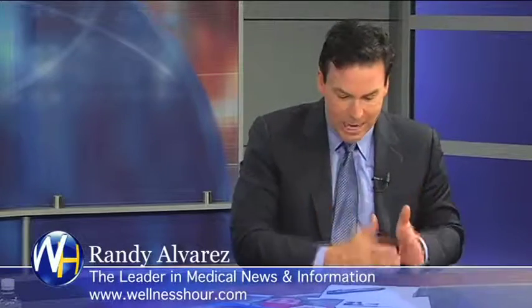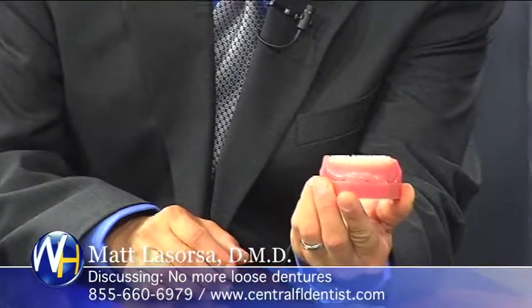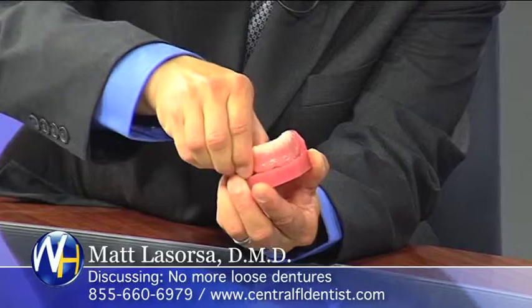Okay, the models. We're going to have to rush to the models for the sake of time. I want to make sure that the denture wearers know their options. So do you show them these models? Yes, I do. The models say 1,000 words. All right. Here is what a lower denture looks like. This is the typical lower denture. And here's what it looks like when we're done with the mini implant surgery, if I can get this off.